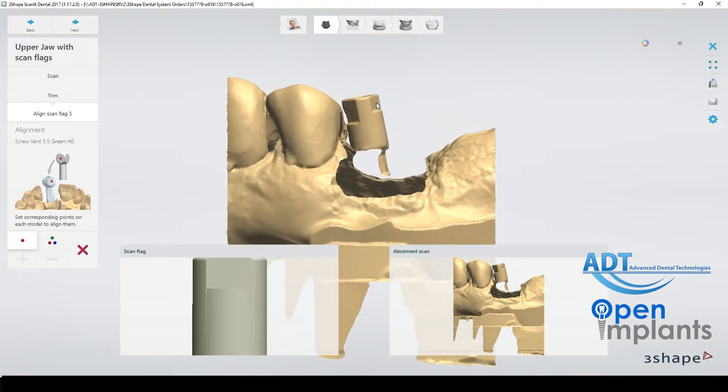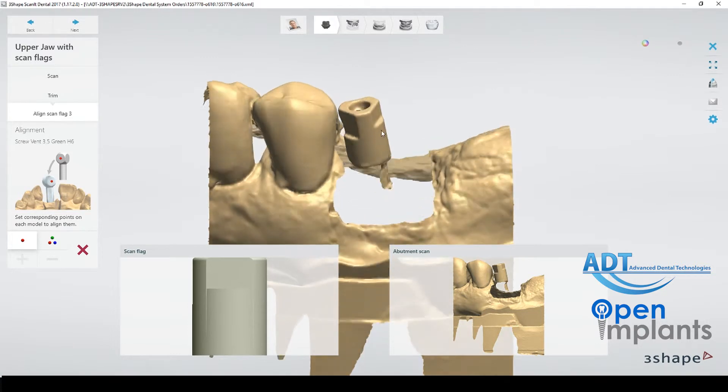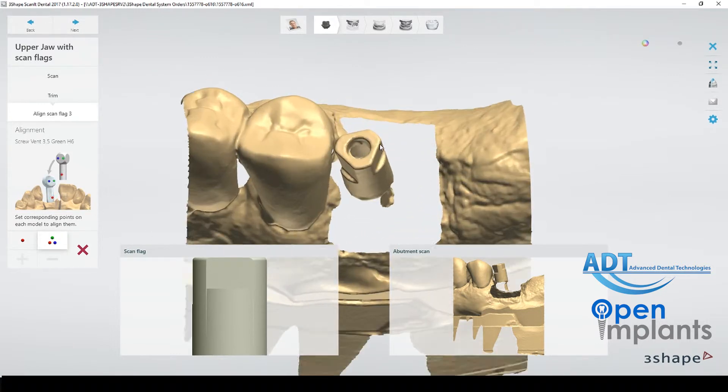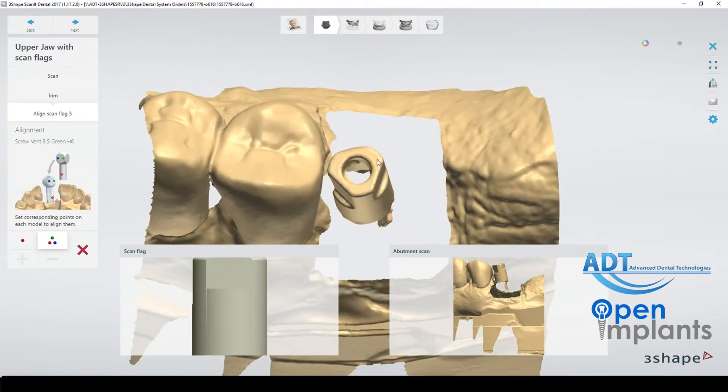Here we are using three-point alignment. These scan bodies are great for this because there are three different sides making it very easy to align.